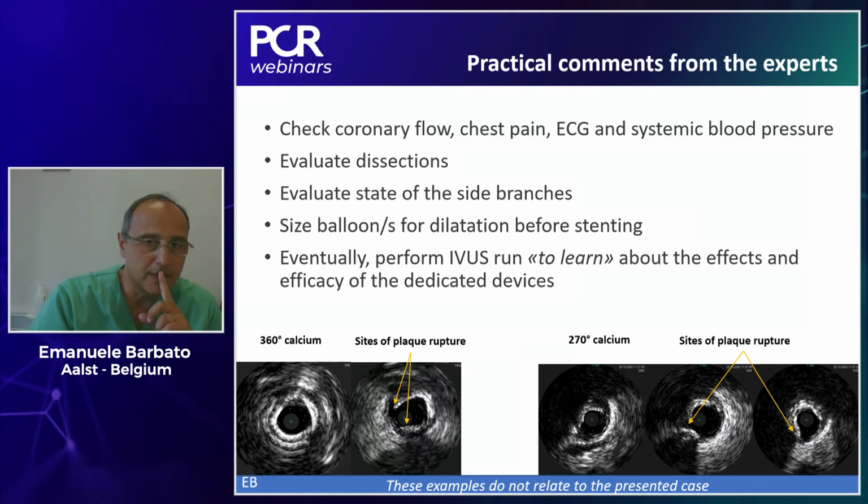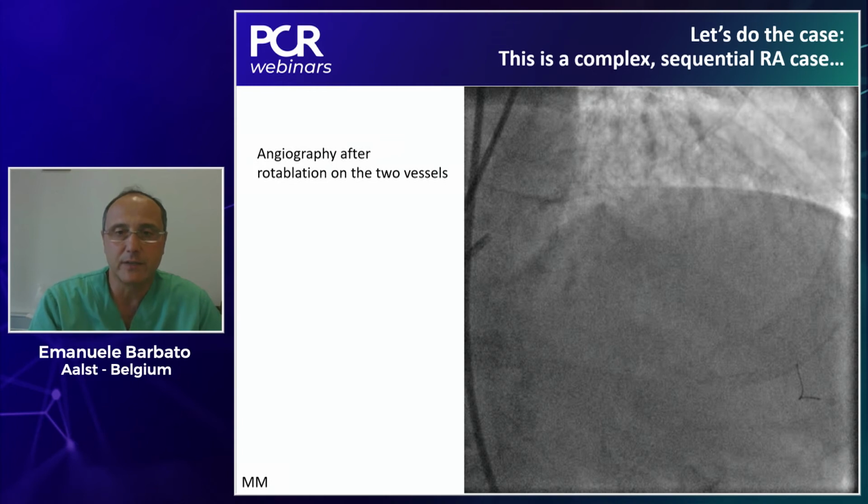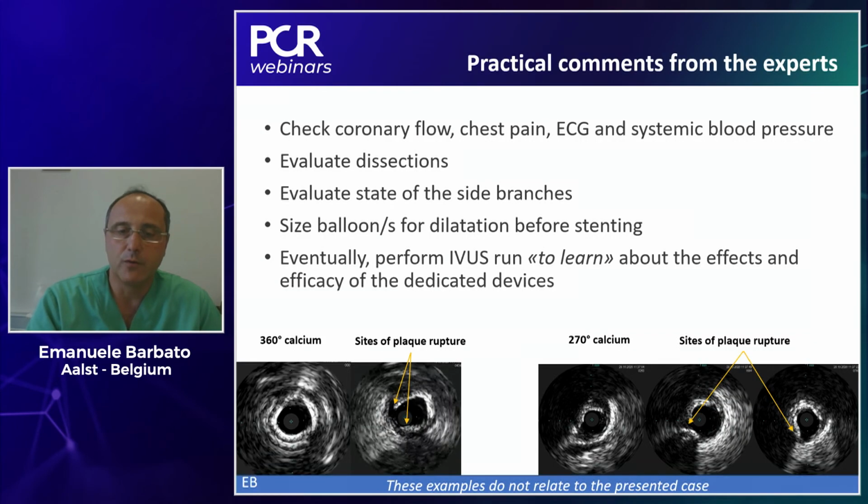But please don't be misled in this specific case. You noticed perhaps at a certain point in time, the flow in the LAD was a bit sluggish. That is not just after burring. It was there from the onset, from the beginning. And this is information you have to keep in mind. So that is why it is extremely important to carefully read the images before you go on with your procedure, because the knowledge of the slow flow at the beginning of the procedure would prevent you from doing unnecessary actions at this point in time in your procedure.